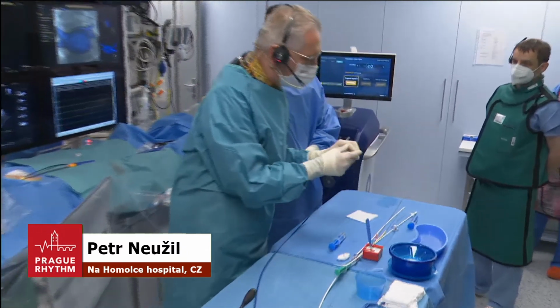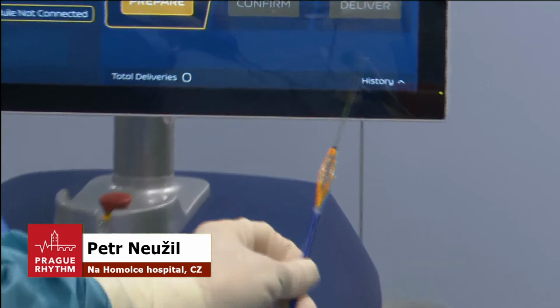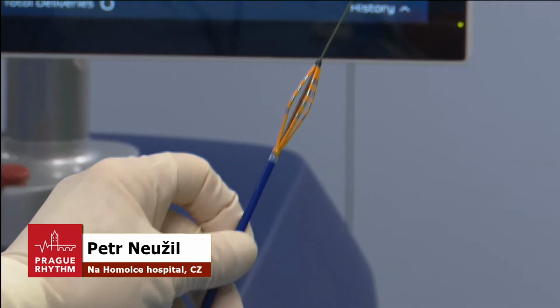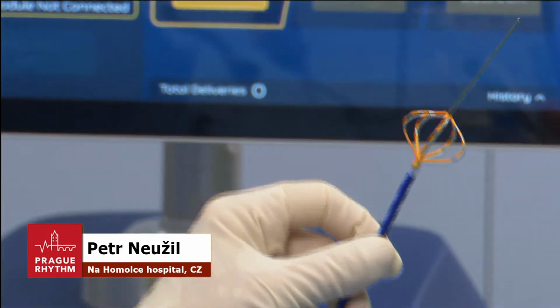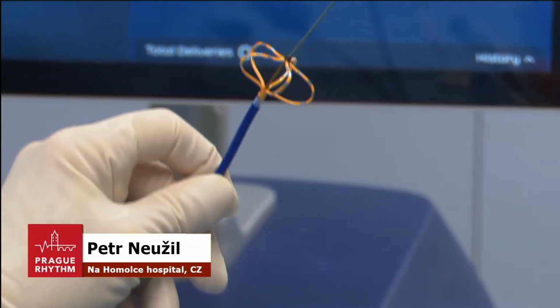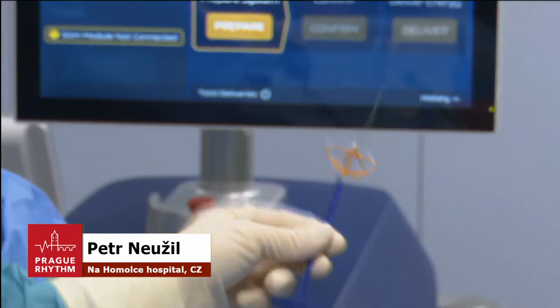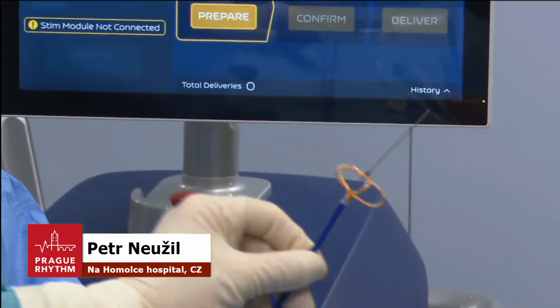As we are speaking about this single-shot catheter, it is named the Farawave catheter, which is based on an over-the-wire system. Inside, in the central lumen, is the wire, and I will show you the two poses. The catheter is designed to get PV isolation first. For PV isolation, the first shape is the basket, and from our first studies, the standard application is 4 applications with the basket, actually 2 applications and then turned by 1 quadrant.